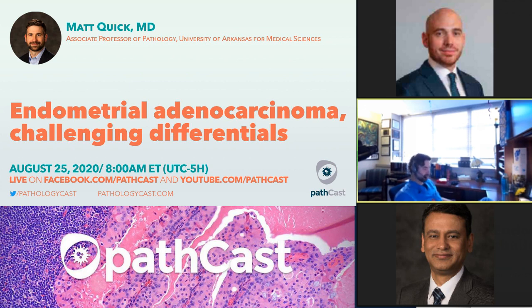So, sometimes you have to approach these descriptively. And I'm not going to lie, that's the tack that I take most times when I'm not confident in my diagnosis. And I don't think it hurts to be descriptive, and it certainly doesn't hurt to call your clinician and say, look, I got a tough lesion here, and we're going to need to work together on this patient to make sure we get the right treatment for them.